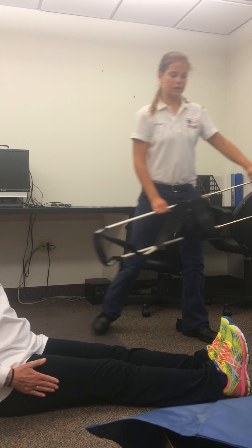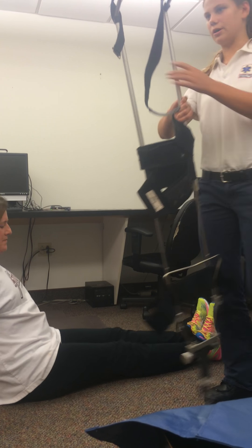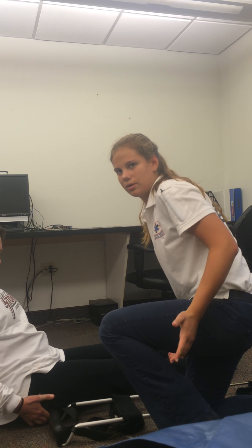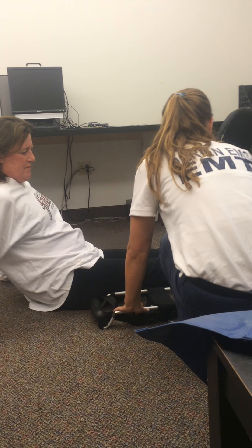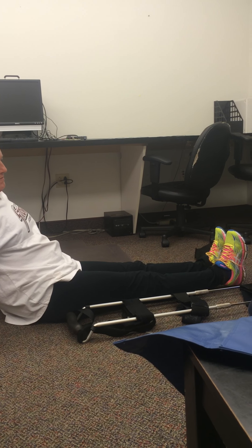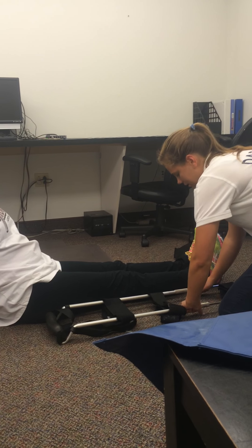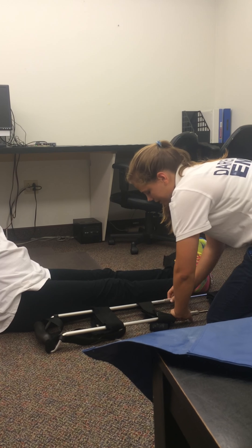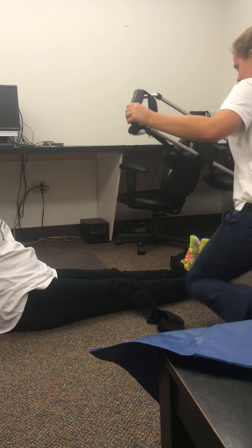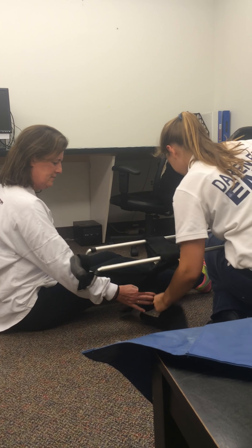If this leg is injured, you're going to want to measure on the uninjured leg. Bring it around — never lift it over the patient, because if you drop it on them that'll be an issue. This bar is going to go mid-thigh, right under their butt, so it will be a little uncomfortable. This end should measure about six to eight inches below the ankle. Turn these to the left to extend it, then turn to the right to tighten it up.